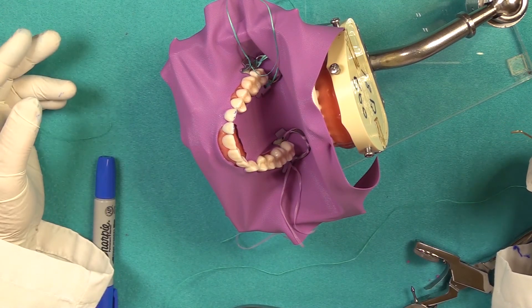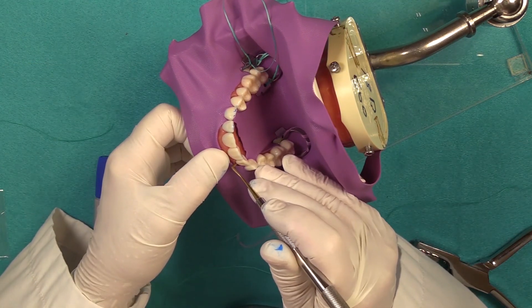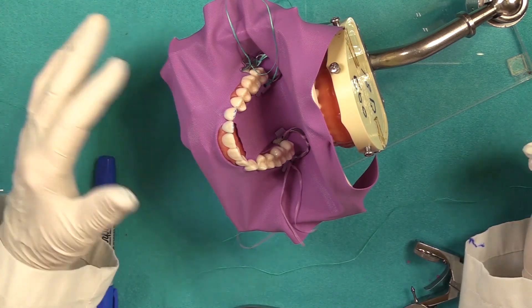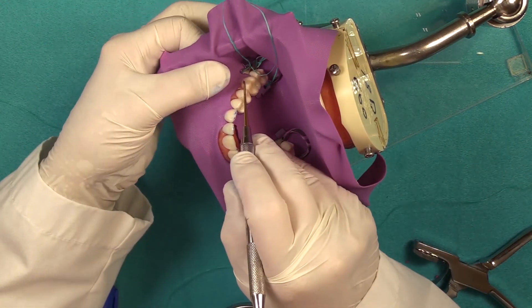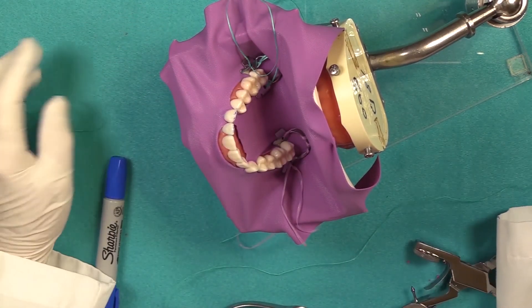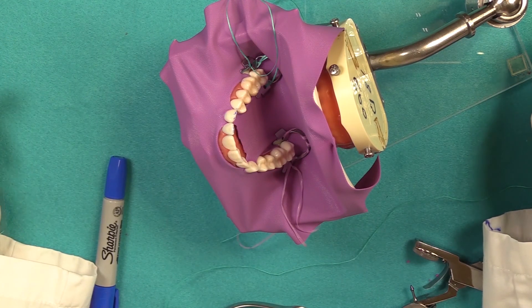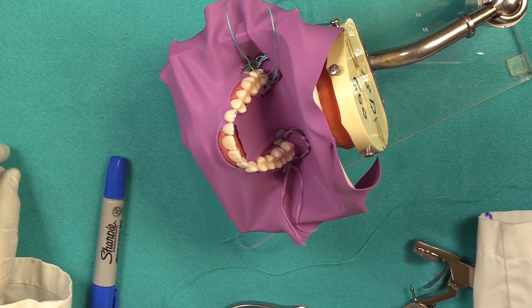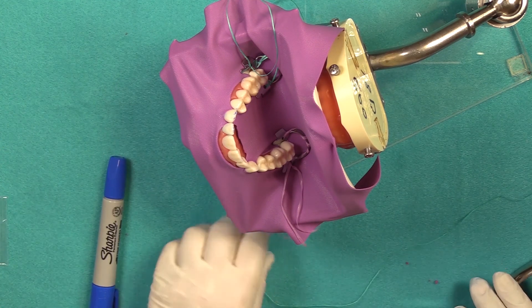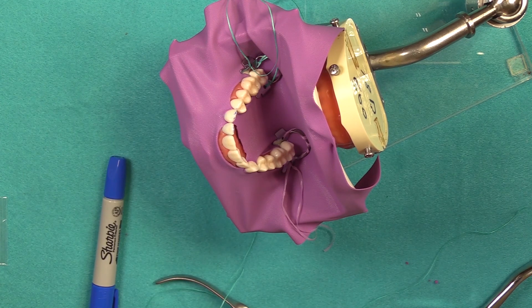In terms of the quality of isolation for saliva, you can use the oral seal dental dam caulking to seal the areas — you should be able to get adequate isolation and certainly expedite placement of your brackets. You don't have to worry about dropping them or any small items. It protects the patient's oral cavity from inhalation or swallowing of any foreign object.